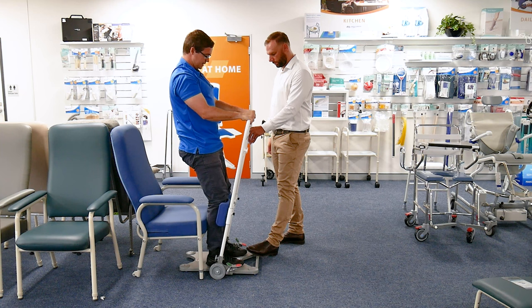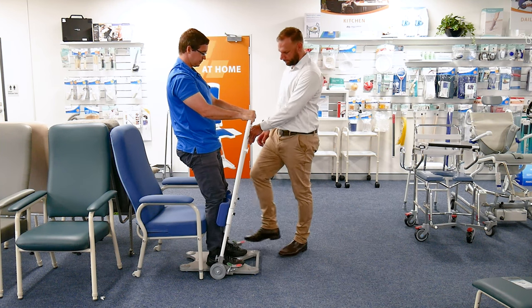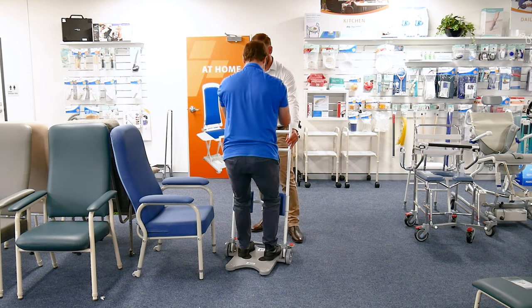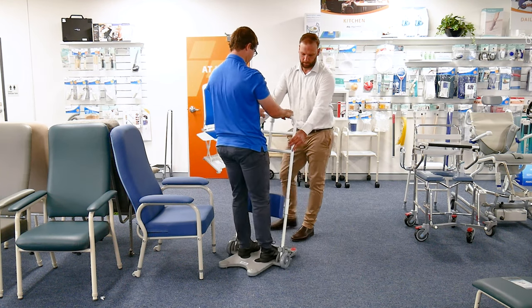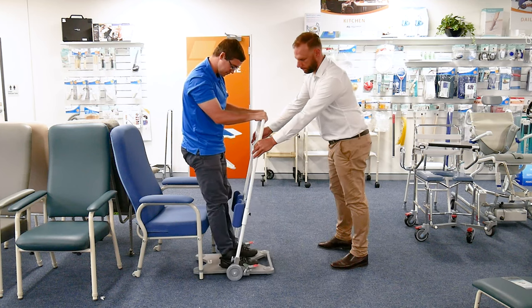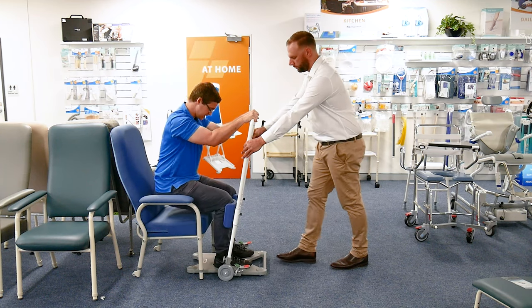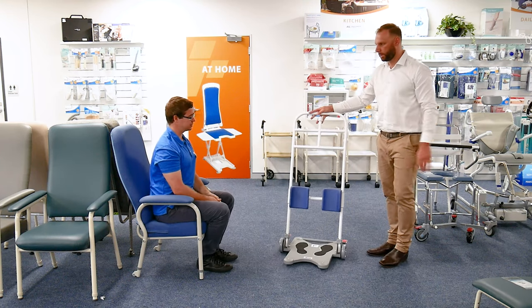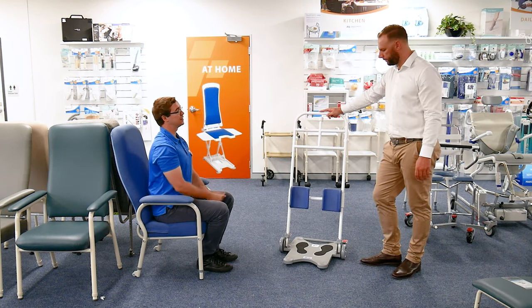I'm going to pull myself up here and get myself up into standing. Release the brakes and then I could be moved to sit back down onto another surface — sitting back down. I was able to participate in that whole transfer myself, which is wonderful, and also quite easy for the carer to move me around.